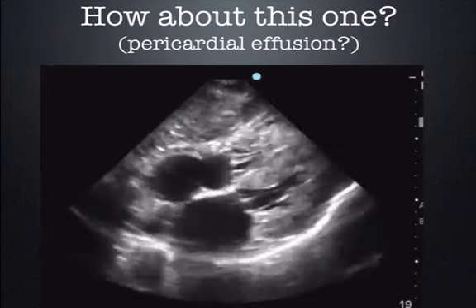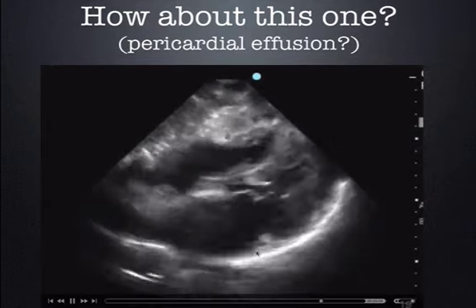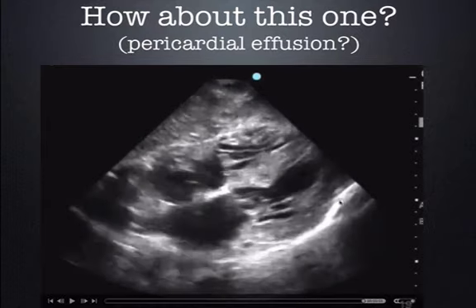So how about this one? Is there a pericardial effusion? Well, you can see right here, there's a pericardium, this bright white line. It goes off the screen here and then comes back around. Here's pericardium.